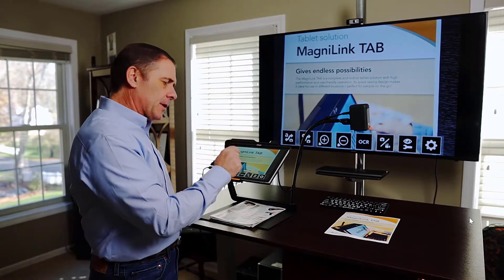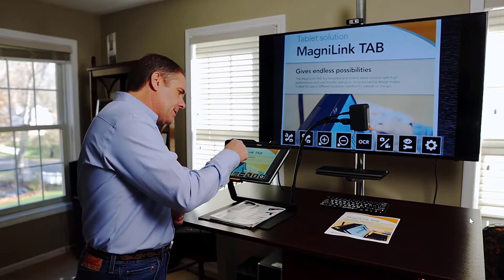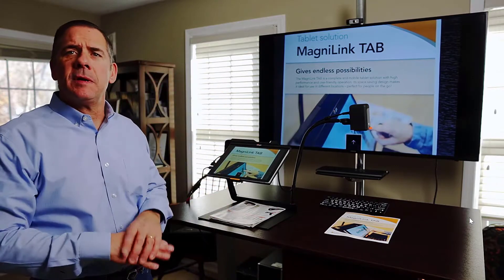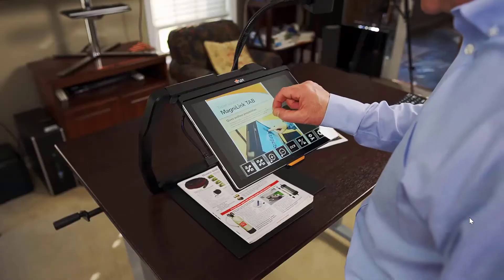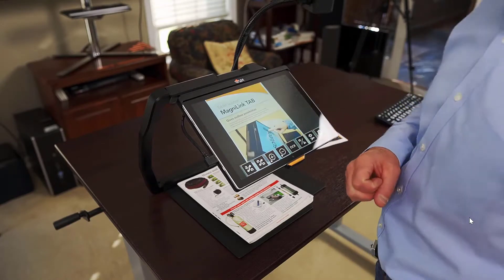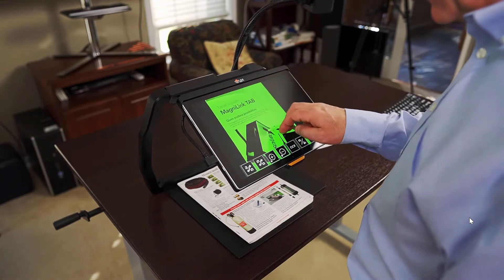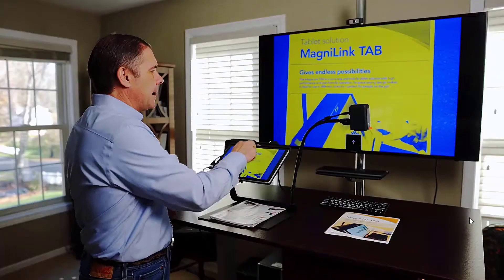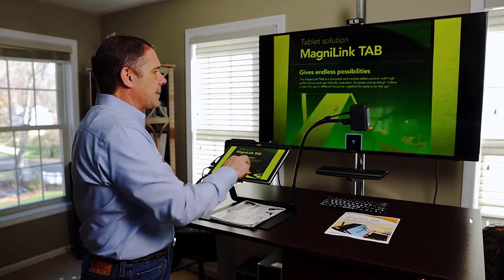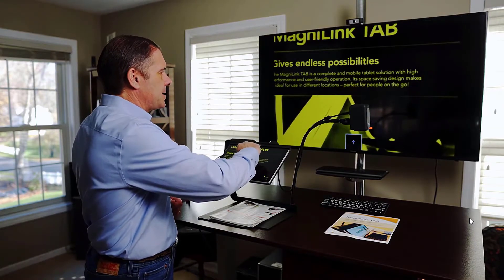Each of these buttons are touch screen. I'm going to remove them for now by double tapping twice on the screen — and they disappear, giving me a little more real estate. To magnify, I just pinch and zoom. If I want to change the contrast for reading, I pull down on the screen, and once I find the one I like, I can stop there and start magnifying.